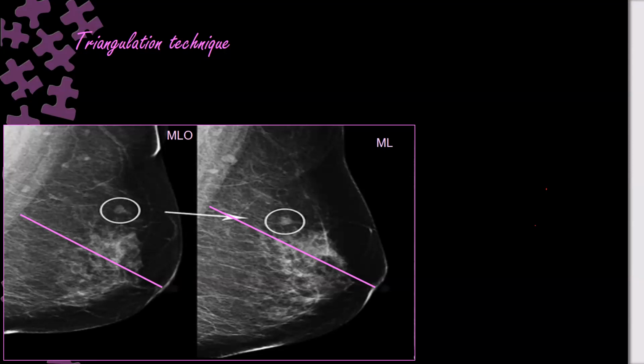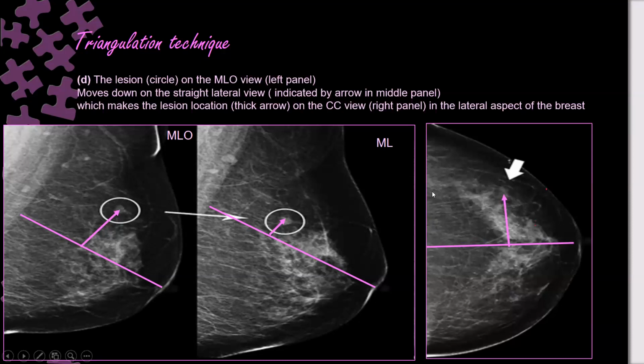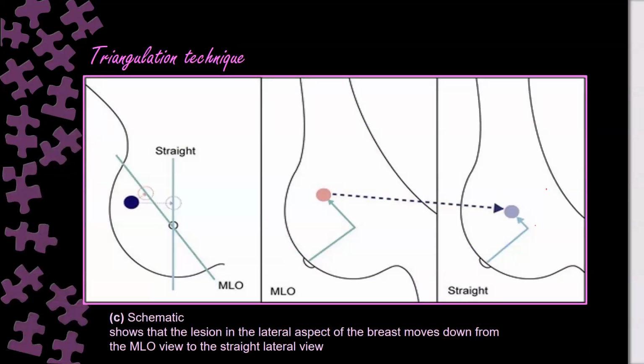Lateral, it sinks. Remember that the lead is heavy, it will fall down. So here it falls down, so expect it to be lateral.